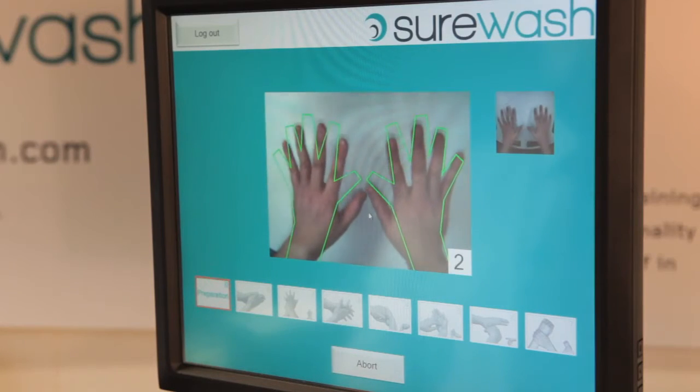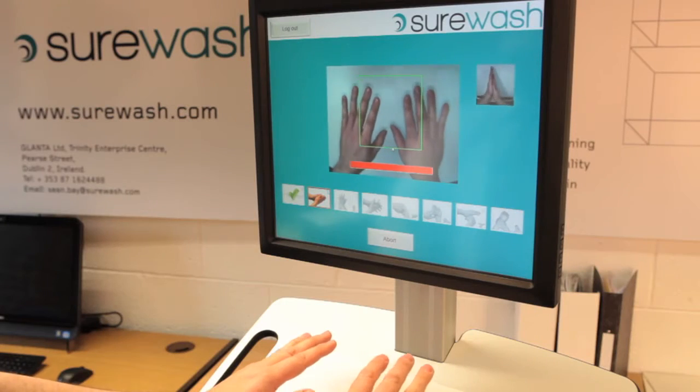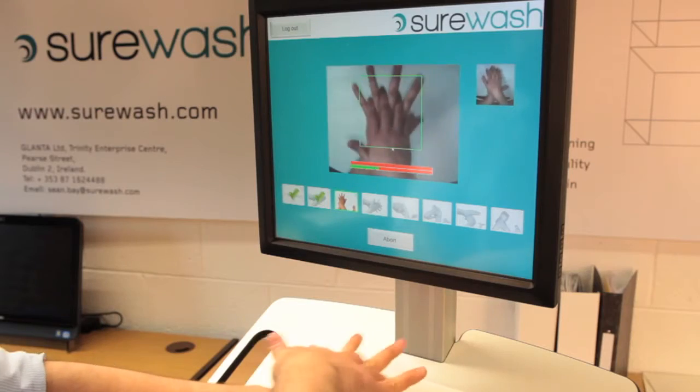What that allows you to do is to look at an actual hand hygiene event. First of all, it takes a picture of your hands. So for the records, it can show nail length, rings, plasters. After then, it asks you to go through the poses one by one, and it gives you instruction on the screen as to which pose you should be doing.